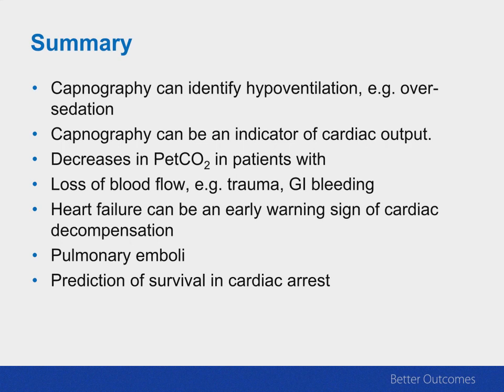So as you look at what we've talked about in a very short period of time, what capnography can do for us, and this is why it becomes the idea that a capnogram can be a new vital sign. So if I put a capnogram on a patient and they don't breathe effectively, for example, if we gave too much sedation or too much analgesia, what will happen is the end tidal will rise. And so we need to either then decrease the sedation or analgesia, or start to plan to support their breathing.